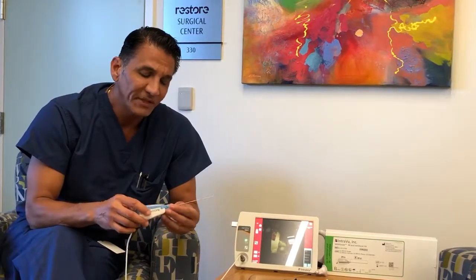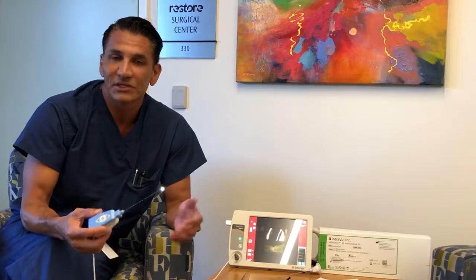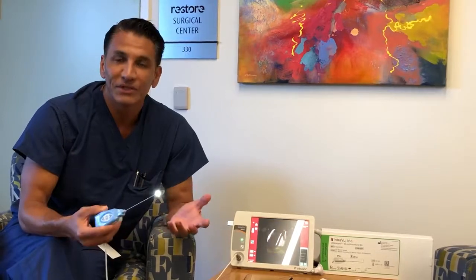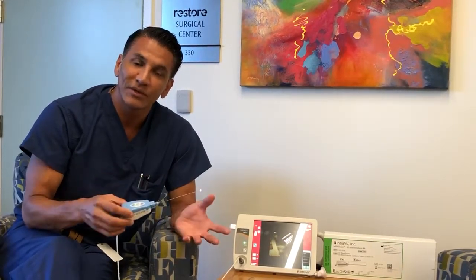Another group of patients, I think this is a little bit more esoteric. It's for people that do more cartilage resurfacing, such as people that do the MACI procedure or OATS procedures and such. Let's just say you have a patient that's coming in from out of town. They come in, they have an MRI. The MRI shows a chondral defect, maybe a grade 3 or grade 4 chondral defect, and they know they're going to need some sort of cartilage procedure. They've been told that maybe they just need a debridement, or maybe microfracture, or maybe something more exotic. So those patients can benefit from this because you can put it into their knee. You already know where the lesion is because you have an MRI that shows an abnormality of the cartilage.